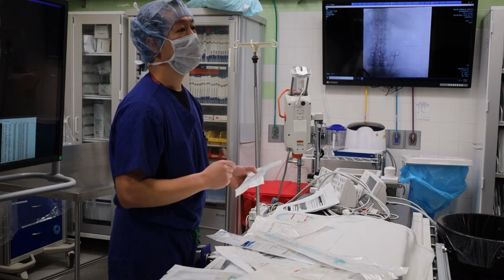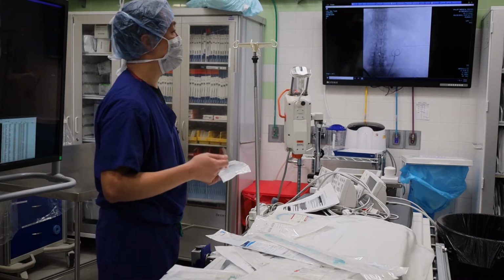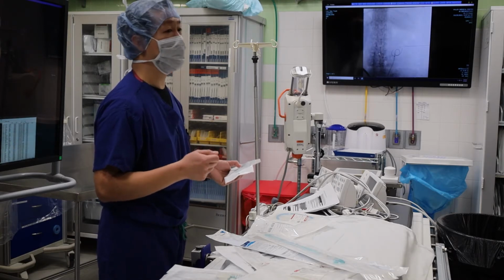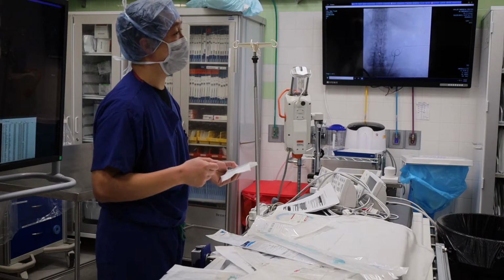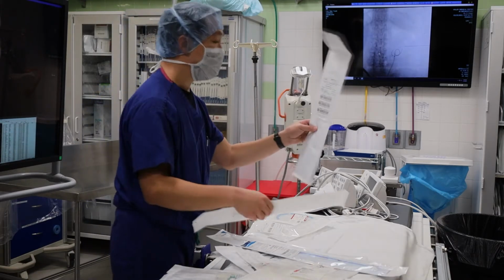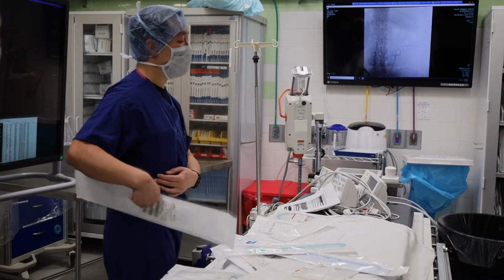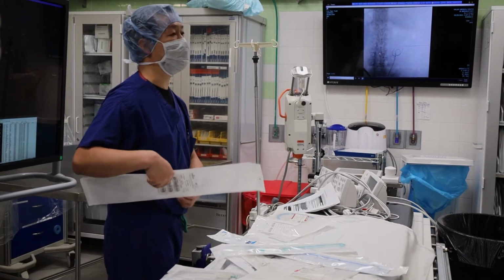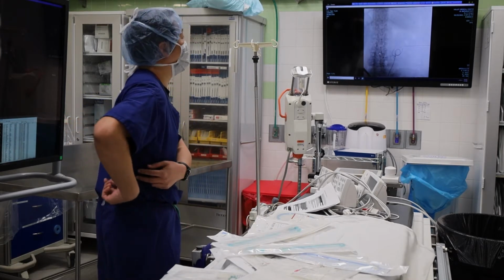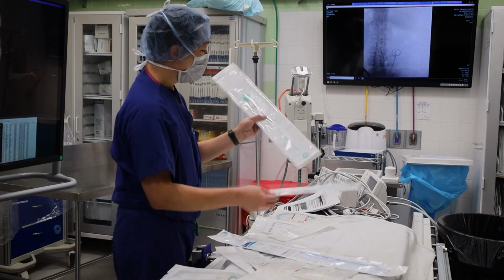A stopcock, right? Have you guys ever tried going to bed at night with a stopcock on your back? It sucks. And then if you do that for 3 months, it sucks even more when your skin breaks down. Okay, so this allows the stopcock to be further out on this side. Okay, and especially our unfortunate patients who live alone and have to try to change the bag or things like that, it's just such a pain. Okay, so longer tubing is for that purpose.